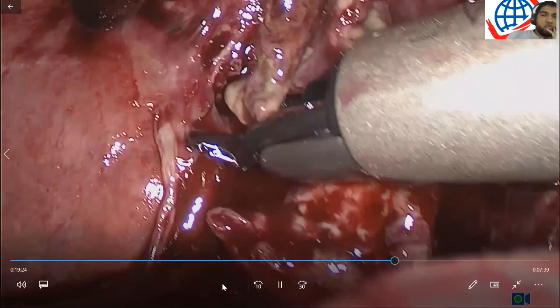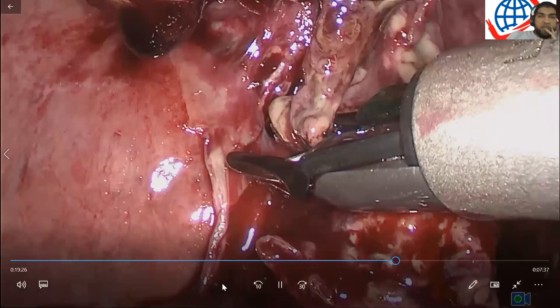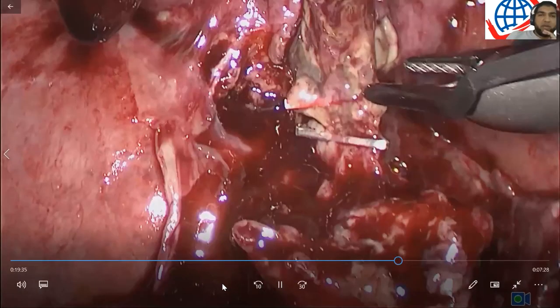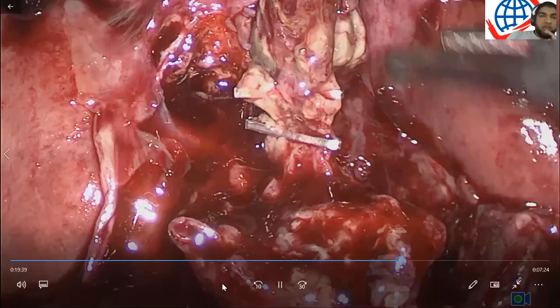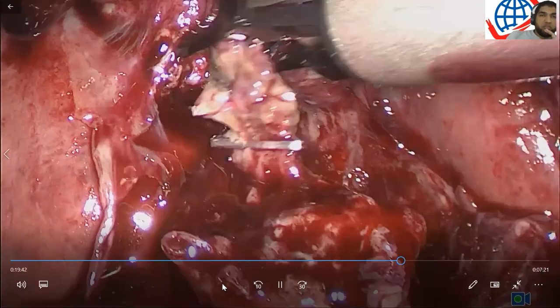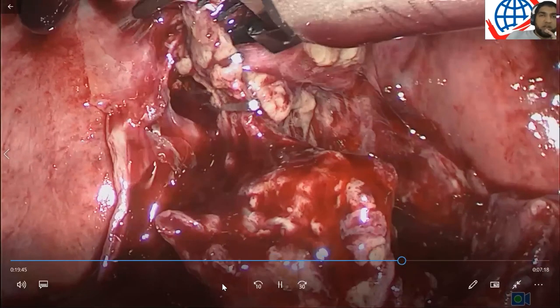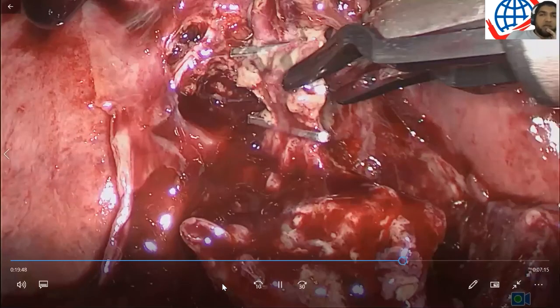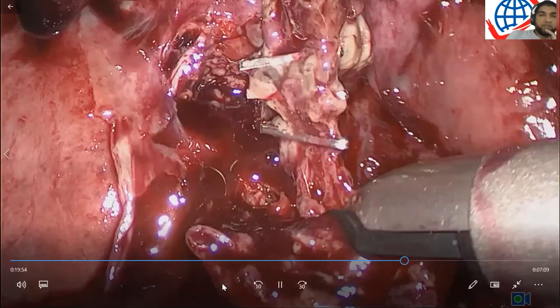We generally use two clips at the bottom and one at the top. Sometimes you'll have a very short structure where the application of the top clip then becomes difficult. Remember, that side is coming out. So use the space to secure the bottom and don't worry too much about the top. When in a case like this, you'll see I turn the instrument around. I always find it's easier to turn the instrument around and place the topmost clip.